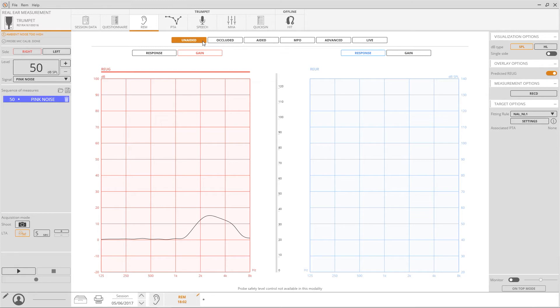Select unaided mode from the REM section. If you are seeking the most customised fitting, Trumpet allows you to acquire the real ear canal response of your patient. Alternatively, predicted unaided measurements will be loaded automatically.